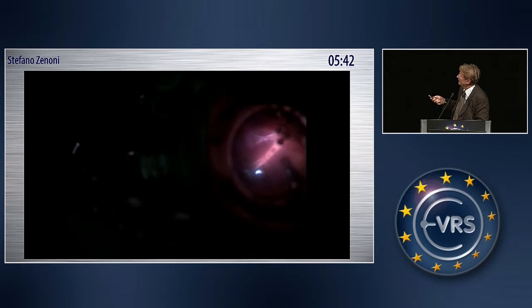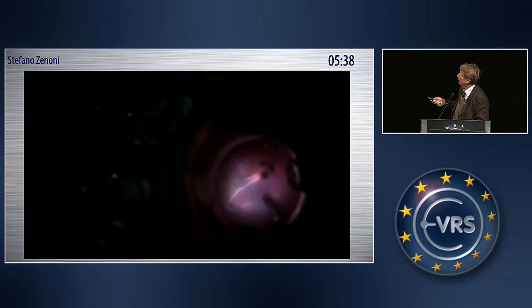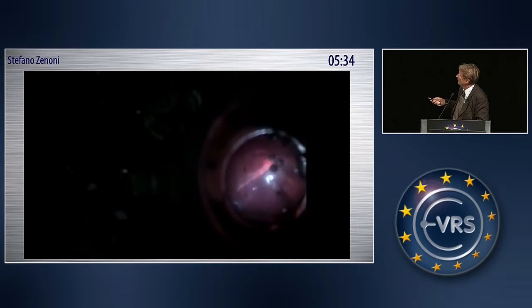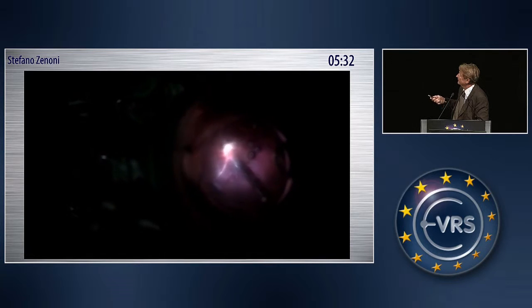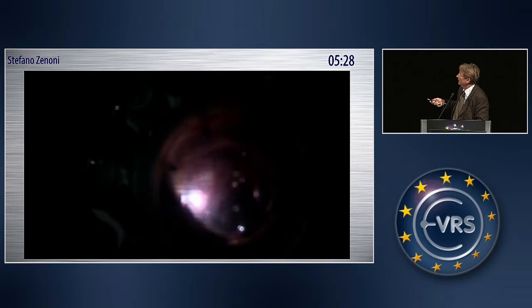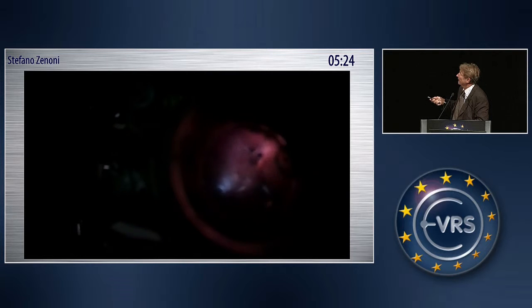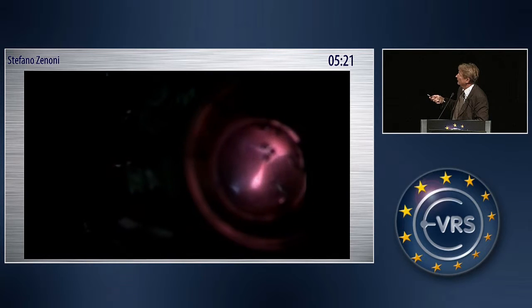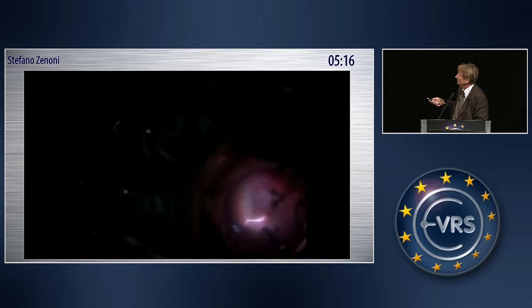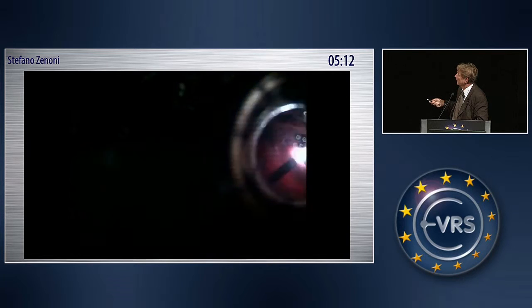But the anatomy inside the eye is completely changed. We have a lot of fibrosis. All the blood has created new membranes, and we have to break these to pass over this membrane. The suggestion is to do this in the nasal quadrant, so that in case of damage to the retina, we don't create any damage to the macula.